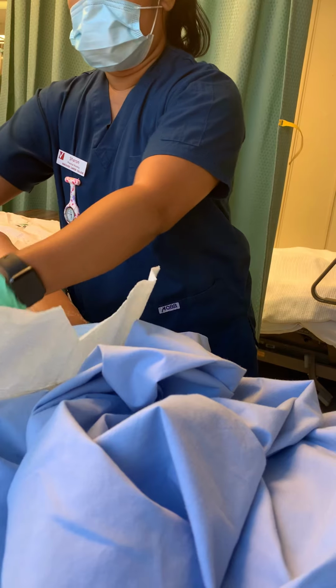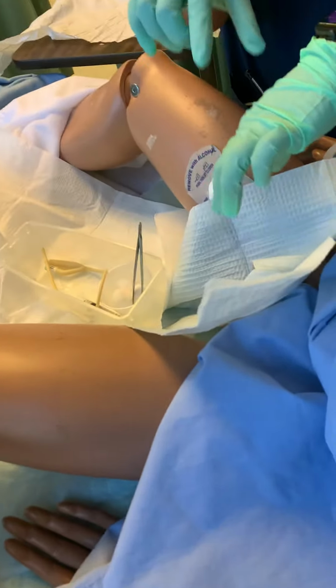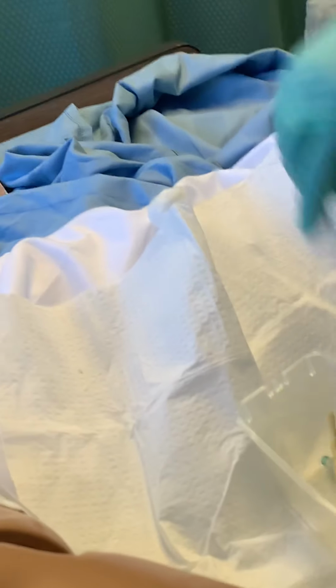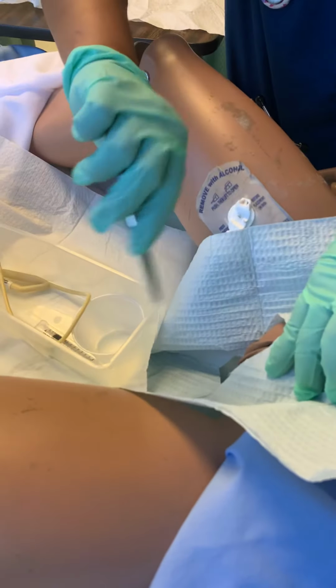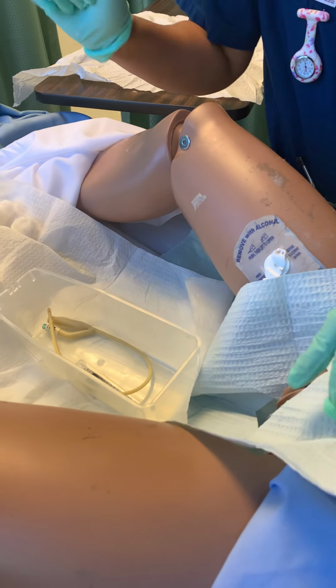Okay. I have to give a quick clean. So this hand, I have to sacrifice this hand. It won't go anywhere, okay? So Mr. David, it's a little bit cold, okay? Wipe down, drop. Do not put your hand so high. Do not put it too low. Wipe down, drop. Wipe down in the middle. Drop. If it's a male, clean the meatus first. 3 times too. And this one goes in the garbage, and this one will go in the sharps container later.